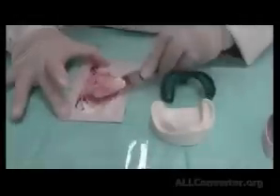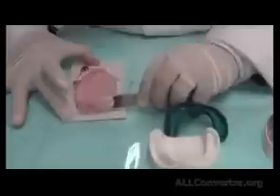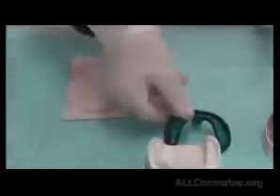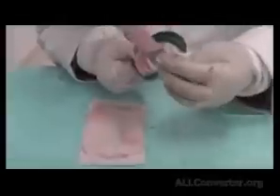First mix it, spread it, gather, spread. We collect the impression material, load it in the lower tray. Going to wipe it into place. We make sure that we spread the material over the borders. We should have all the sulci covered.